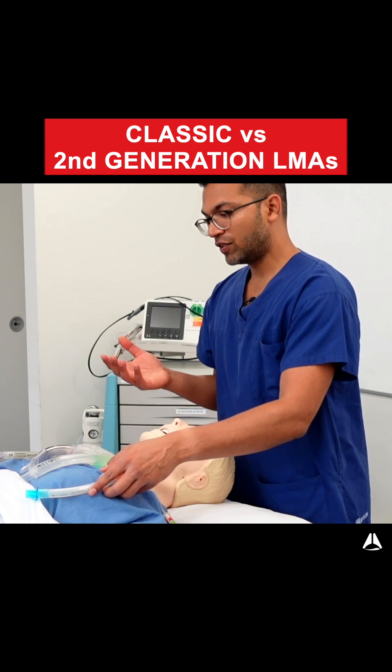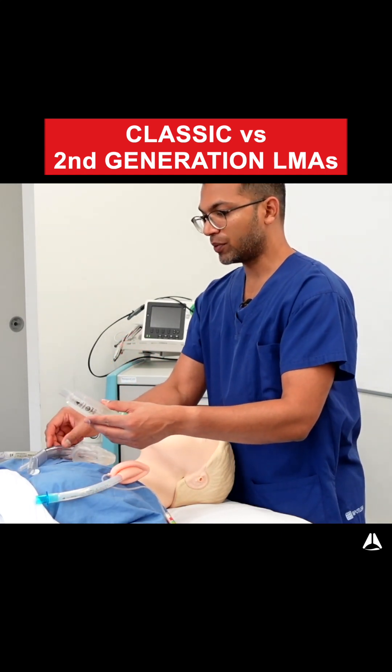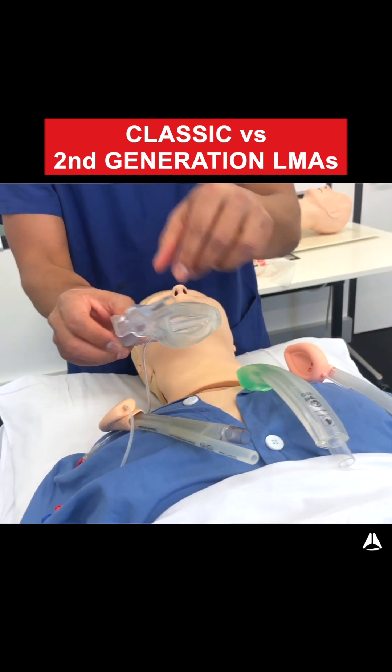The second generation LMAs have a few different features. They have a gastric port — this one shown here — which often sits at the tip of the LMA and leads out.